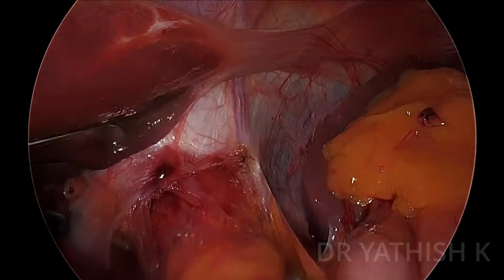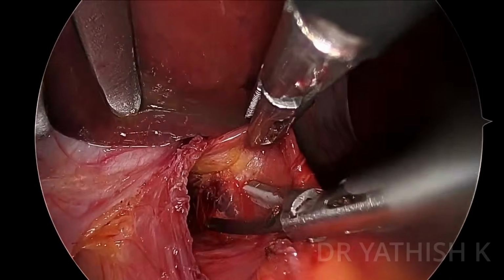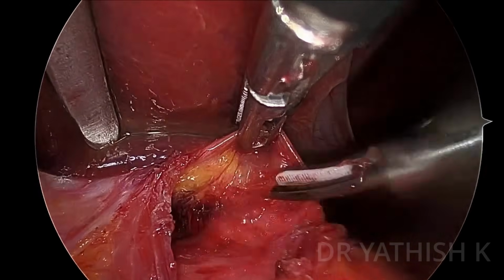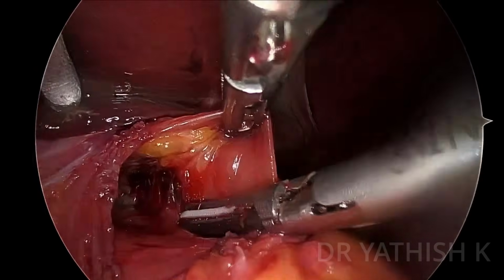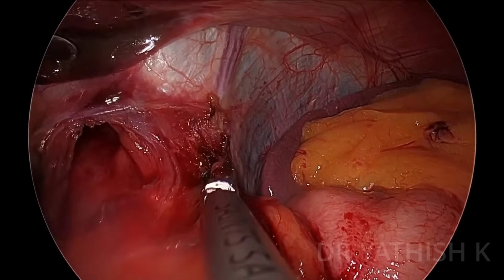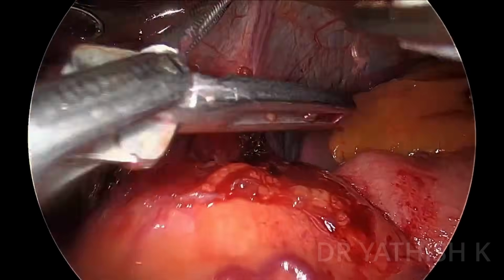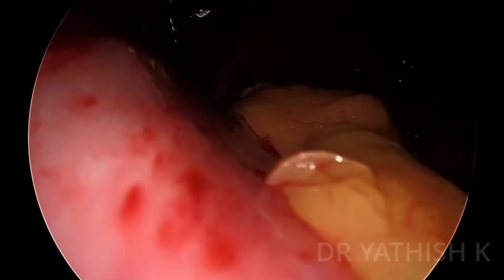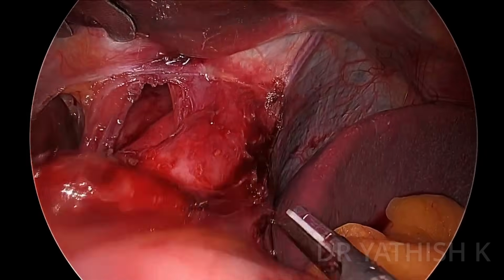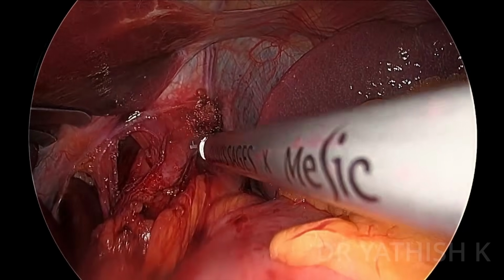I'm taking off those last few phrenoesophageal attachments to mobilize the fundus. You can see I'm working on the left crus and mobilizing the esophagus off the left crus. Care has to be taken because you'll have your anterior vagus running in close proximity. Make sure the active limb of the harmonic is not facing the esophagus, because the active tip can injure the nerve. These are the final few attachments of the left crus to the esophagus.